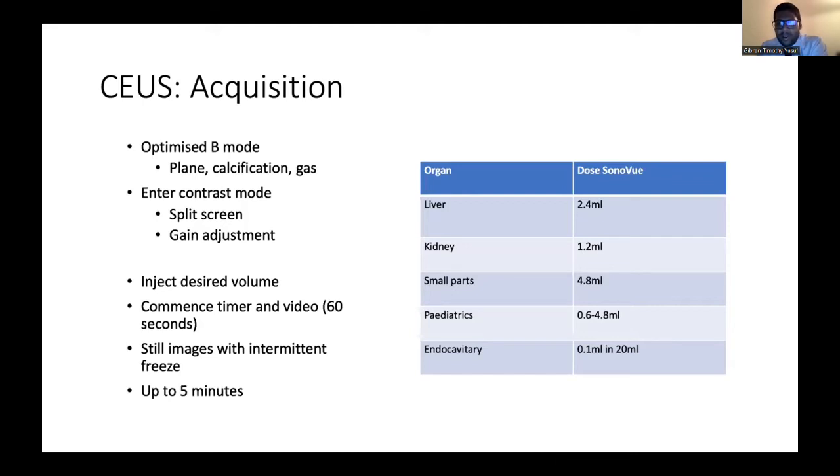I feel it's very important to keep a video clip. The reason for this is it's quite hard to make a diagnosis in the room, and I don't feel like you should necessarily be forced to make the diagnosis there and then. You have PACS or Sectra-based systems which you can retrieve and you can review. You'd simply not think about looking at a CT live and only reviewing it in the acquisition room. So why should you do it with an ultrasound? You take your time because you are changing a patient's life potentially.